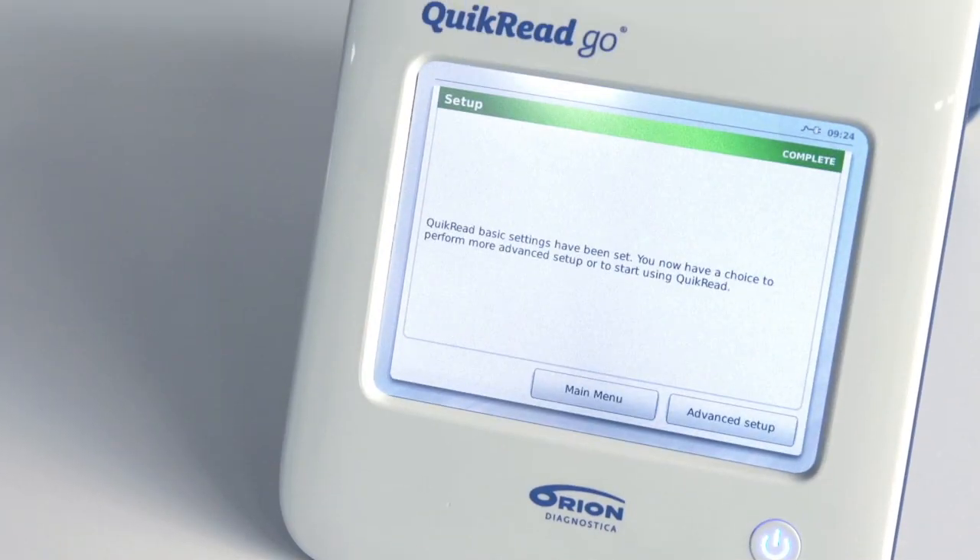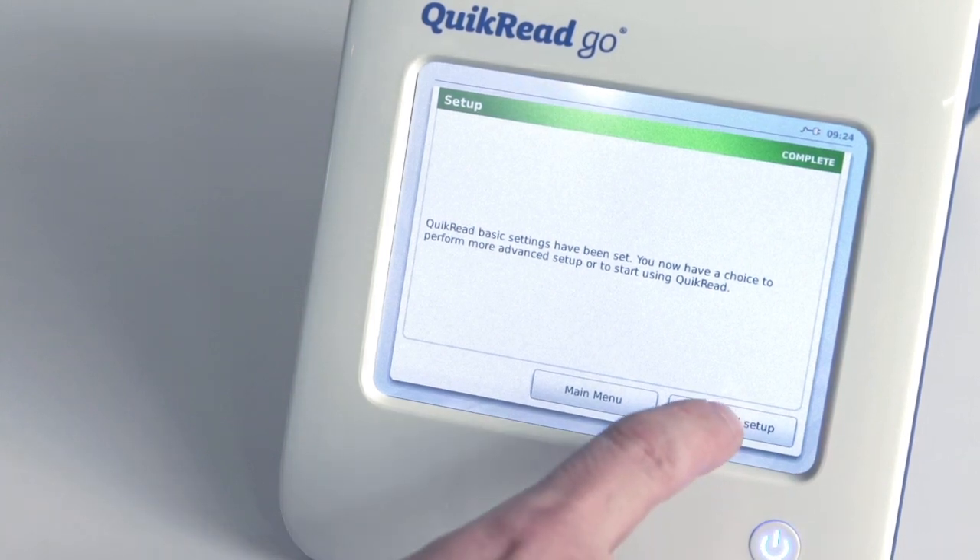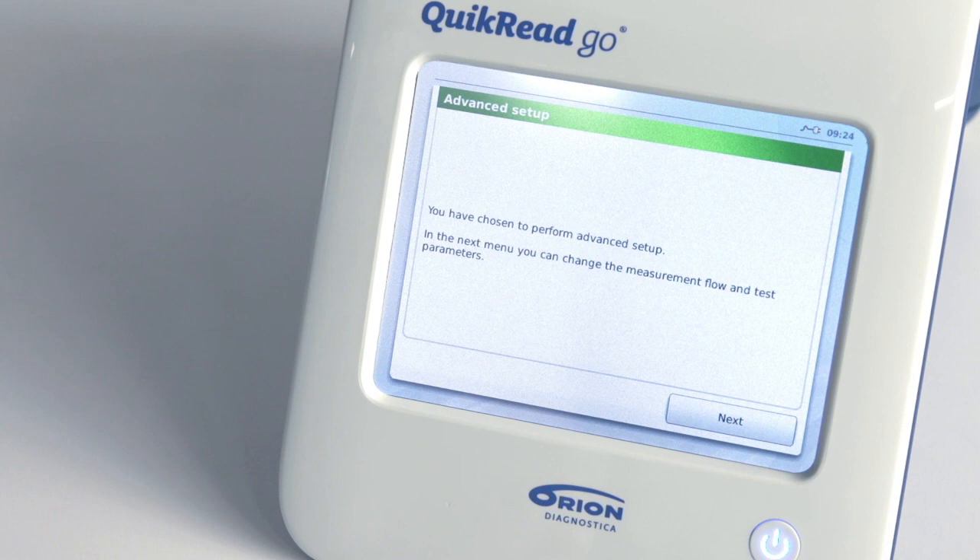If you are satisfied with your settings and want to use Quick Read Go in the basic mode, choose Main Menu which takes you to the main menu and you can now start running patient tests. If you want to use a patient ID, an operator ID, print or send results to a laboratory information system, or make test specific settings, choose Advanced Setup.